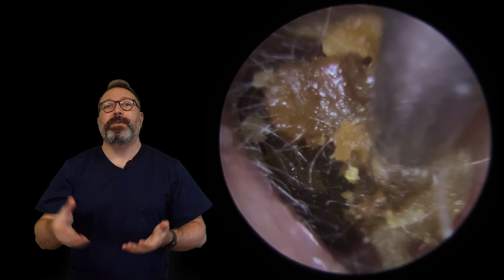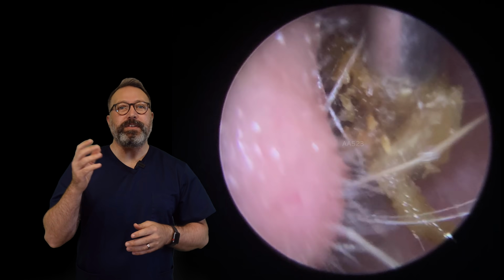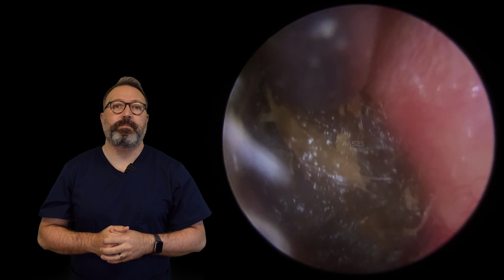But it's taken a nice big chunk away with it, which is great. So let's get rid of that. Anything we take away is going to give us more space, more maneuverability. When we need to wiggle something back and forth, if we've got a little bit of space around it, obviously we can get a bit more of a wiggle and it'll move a bit quicker.